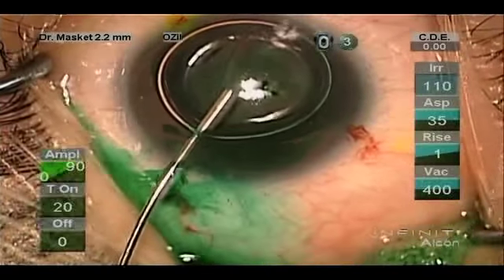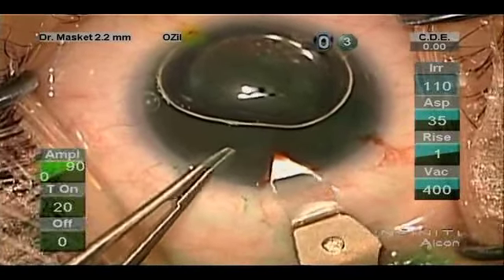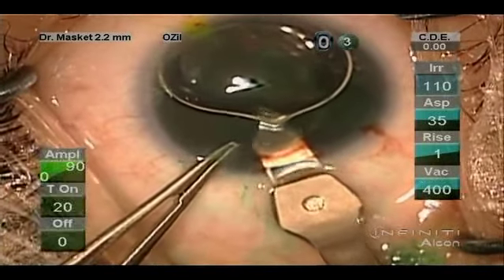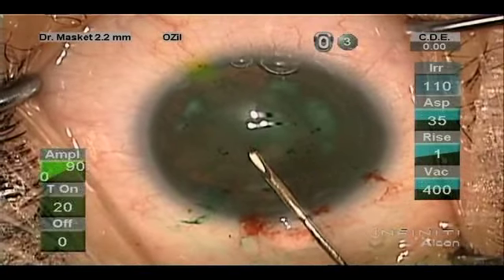In this case, we're using indocyanin green as a marker and stainer of the anterior lens capsule, and making a 2.2-millimeter incision into the anterior chamber through the temporal clear cornea.